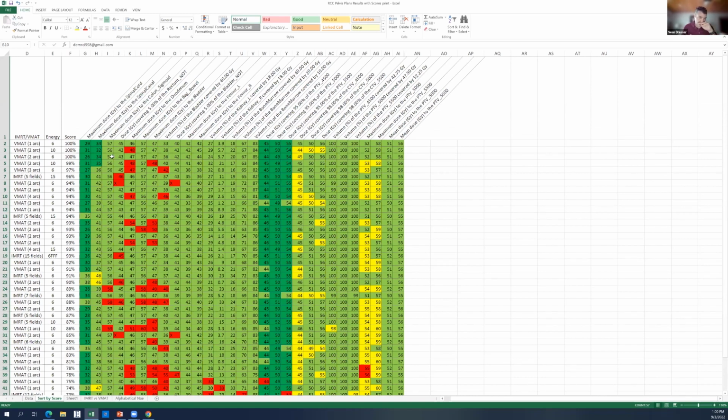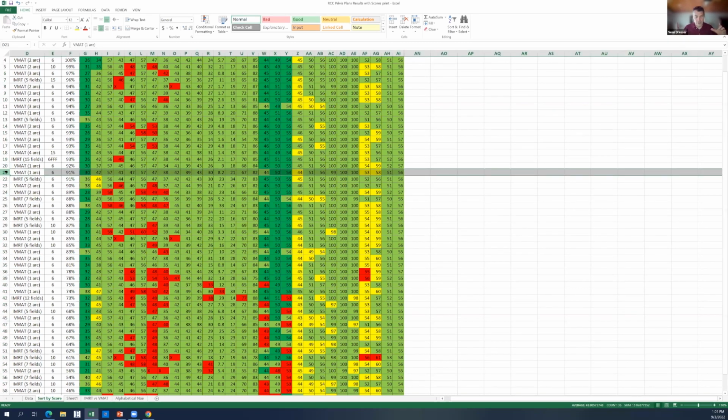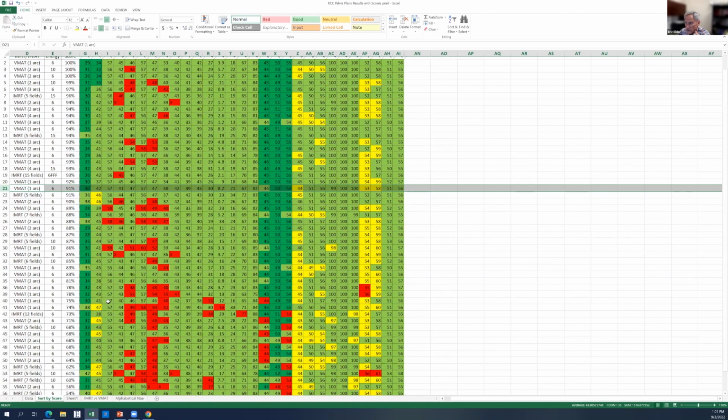But just so you know, some of these plans that you see all green on, maybe 100%, don't always meet all the objectives, and there may be other issues. You may have some dose outside, or your rings might not be pushing the dose in. For instance, these 2 plans here, a VMAT plan and an IMRT plan, you'd expect them to be doing pretty well, because they're relatively green, right? Yet they scored less than something that has even a red on it, right? This one didn't meet the maximum dose to the duodenum, but it still scored 100%. So there's no perfect plan.